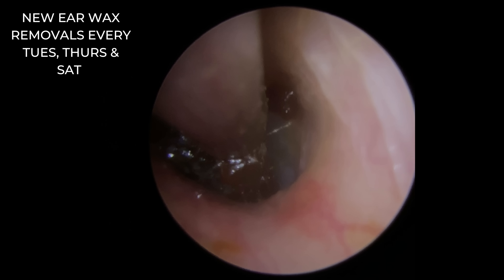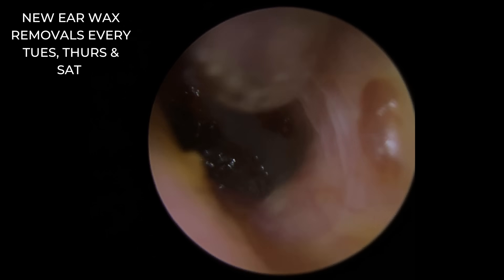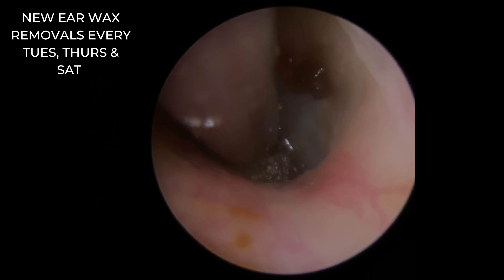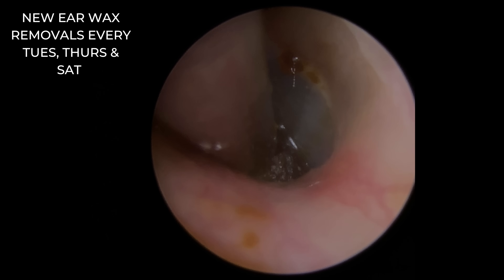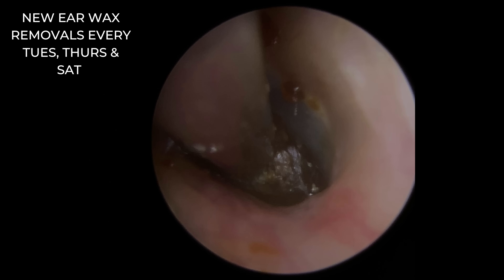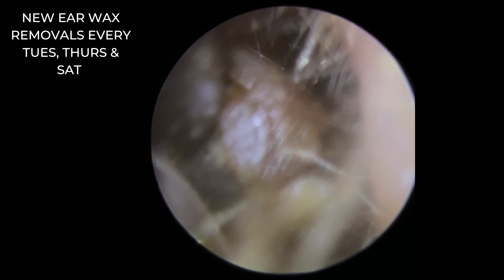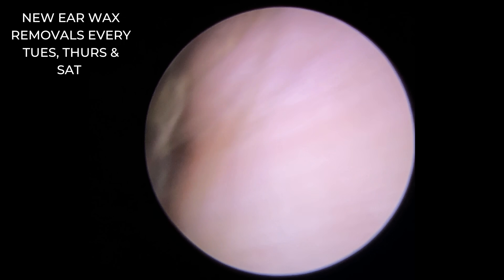You can see that flick straight off the eardrum — so that's another piece gone. Looks like there's still more to the left-hand side. You can see how the wax is moving — that top piece just jumped towards the suction. So we don't always have to plant the suction on top of the wax; sometimes if we hover just above it, it'll draw the wax to the suction itself. Out that comes all the way down. Look how big that piece was, and it was resting right up against the eardrum. You can really see why this patient would have had quite a bit of difficulty with their day-to-day hearing.